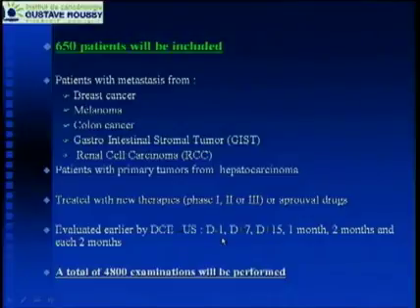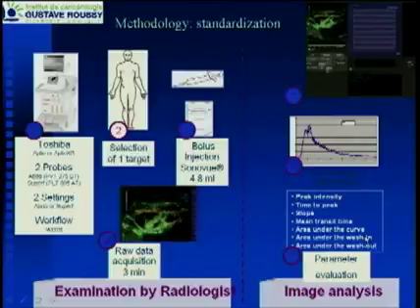All patients had a baseline examination, then an examination after 1 week, 2 weeks, 1 month, 2 months. And we perform a CT scan at baseline and every 2 months. We standardize. Remember, for functional imaging, the key point is standardization.